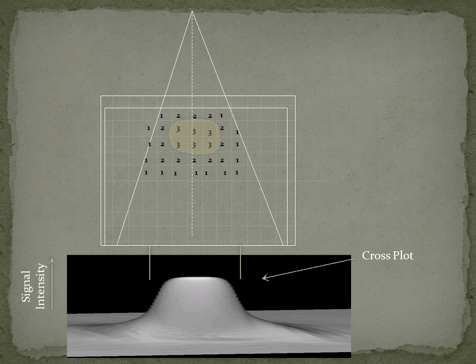When I look at an isodose curve, what I see is this rendition down below, which is the fact that I've got a radiation beam, and if I look at it in 3D, this radiation beam over the plateau of background dose gives you a bump or a region of volume of radiation intensity. And what this representation does is it tells me that the intensity of the beam over the central region is relatively flat, and then it tapers off very rapidly.